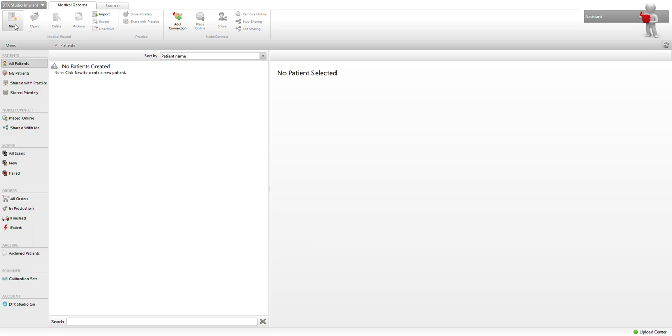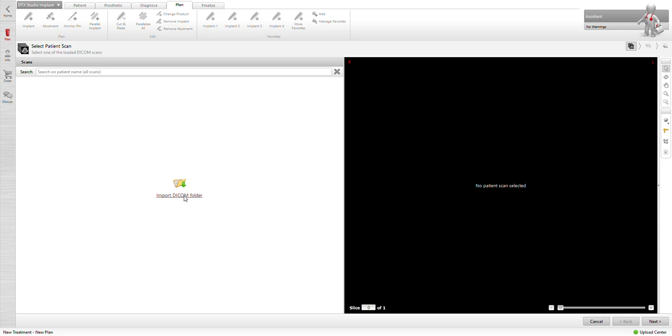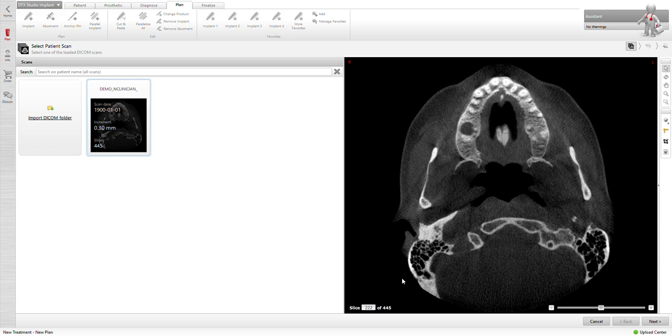Simply we're going to hit new, create new treatment plan. We're going to import our DICOM file, which I happen to have on desktop. I'm going to single click the file. I don't want to double click because then I'll get all the individual slices.